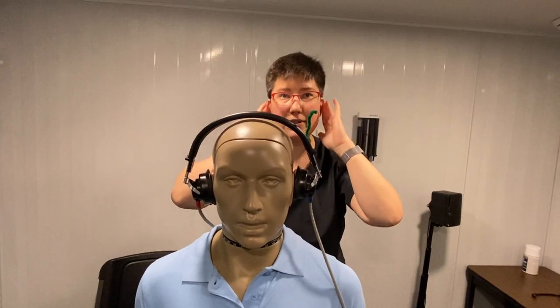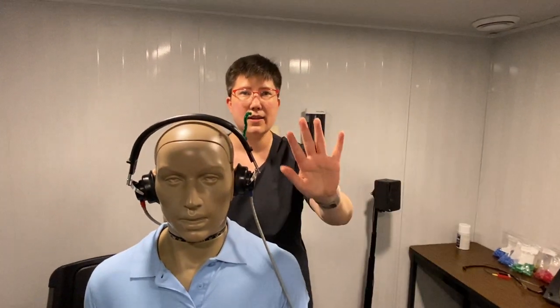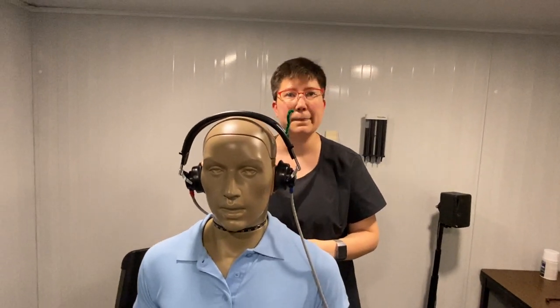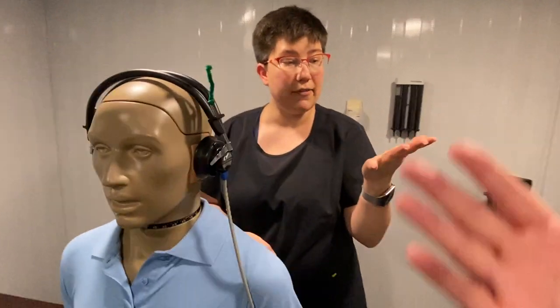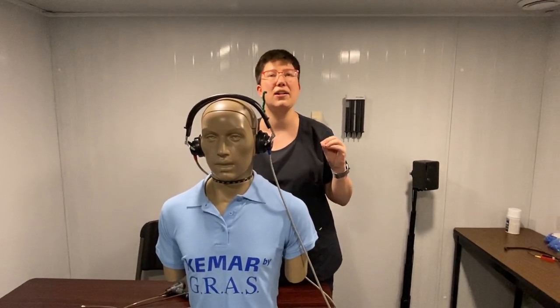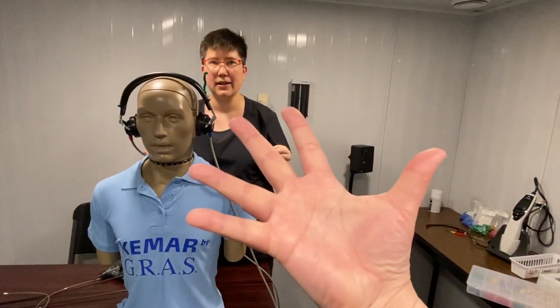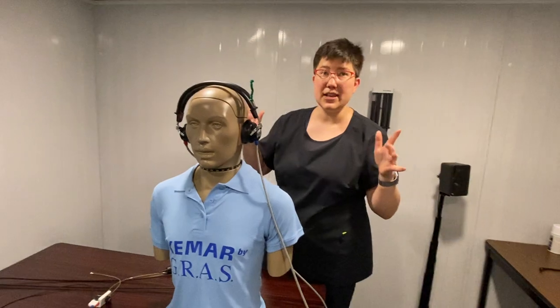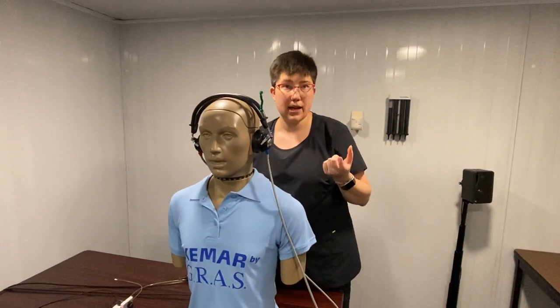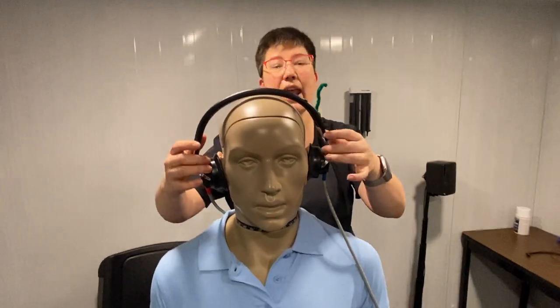You don't want to fold the pinna down. I've had people tell me their hands are too small — Dr. Burns and I may have the smallest hands on earth and we can do it. We have very tiny hands. I wear extra small or small nitrile gloves. We'll never be amazing pianists, but it's okay. I have to use special short stubby impression syringes, that's how small my hands are, but you should be able to do this.